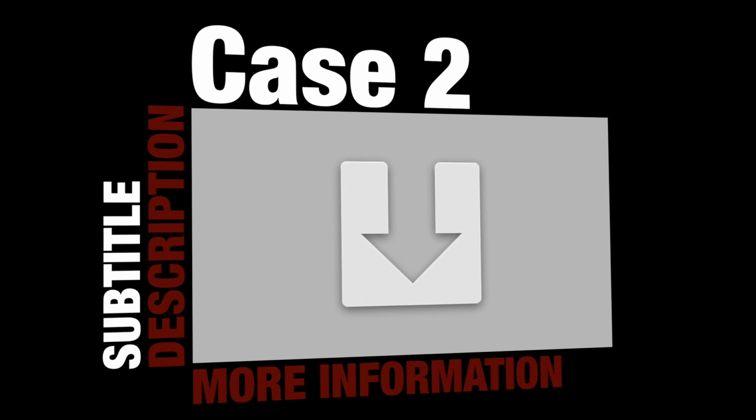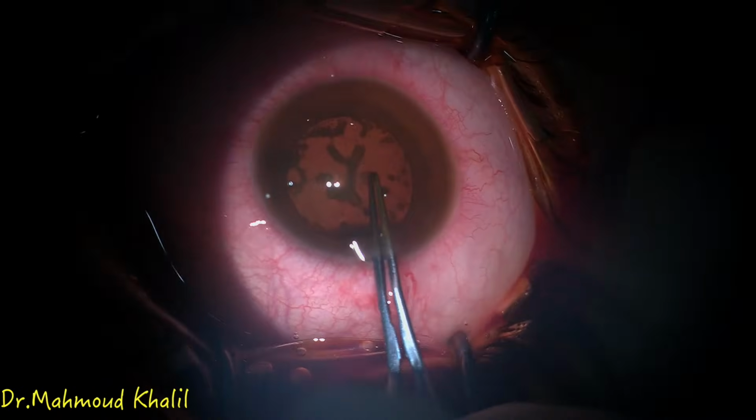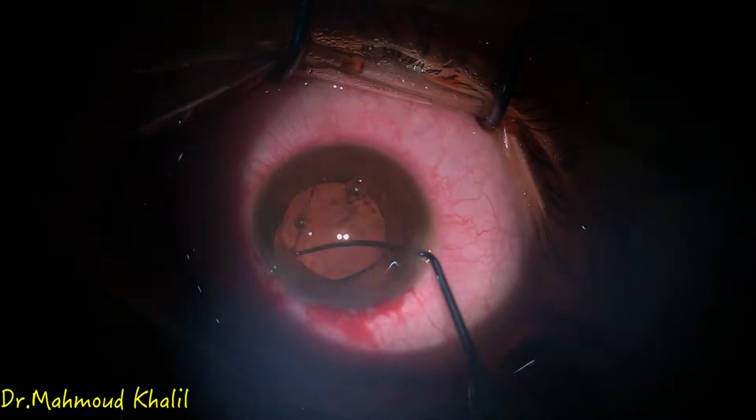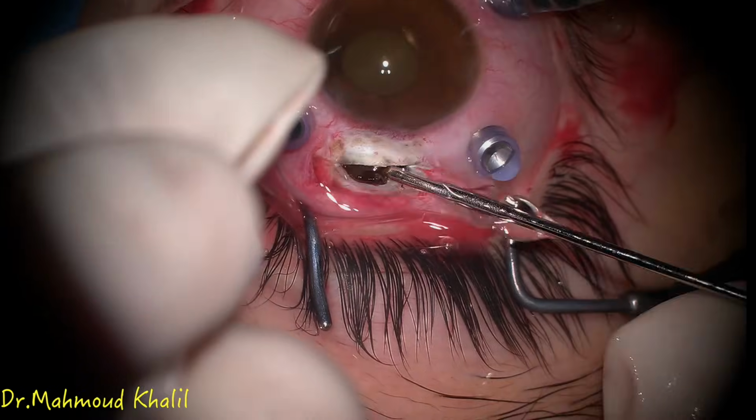The second case is a patient with signs of siderotic changes, as we see, subcapsular spots. Going for cataract surgery, implanting the IOL, and then going down. As you see, there is a vitreous haze, so doing a core vitrectomy and searching for the foreign body. The foreign body is entangled below the retina at the periphery, freeing the retina, and then going for removal of the foreign body using a pars plana incision.